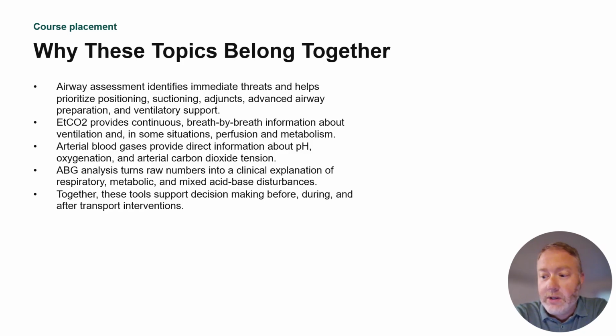ABGs tell us the pH, PaCO2, the bicarb, the PaO2, SaO2, etc. at any given single moment. We're going to treat these as three parts of one story, not just three separate skills. And transport clinicians need to see a pattern, not just a monitor number or a gas result in isolation.